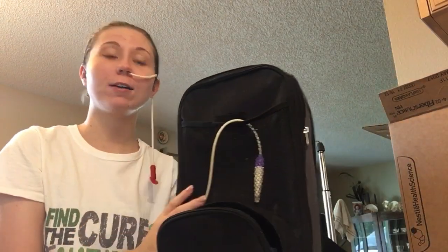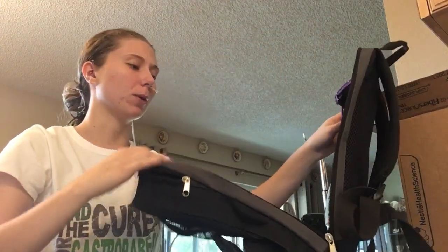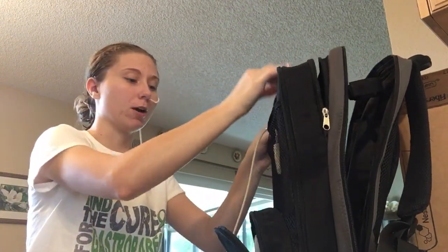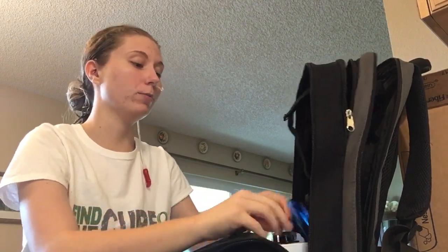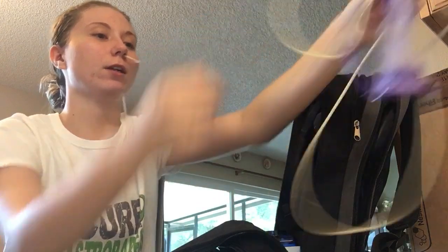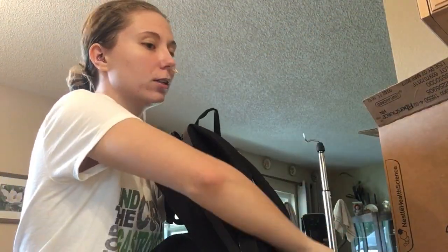Alright, first I have my bag and pump in my backpack because I don't like hanging it on my IV pole and having to transfer it when I want to go out of the house. Plus at night, keeping it in the backpack and just hanging it on my pole keeps the light from shining in my eyes. So what I'm doing now is taking out the old bag from my pump, and I'm just gonna throw that in the garbage when I'm done. Find the cap for it.